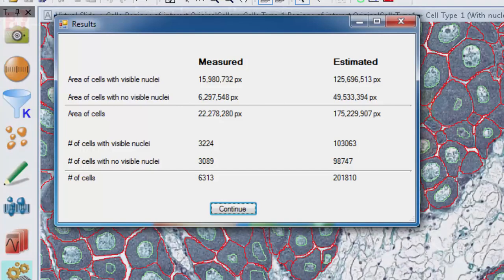The masks generated earlier of the full region of interest can be scaled and applied to the high-resolution images of the subregions. In this example, cells with nuclei and cells without nuclei are identified and measured using the high-resolution images.